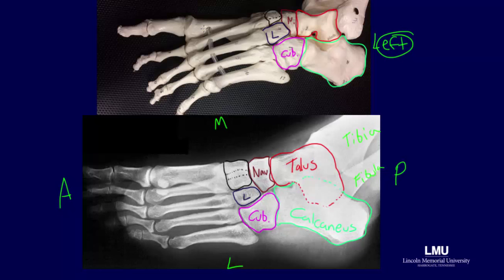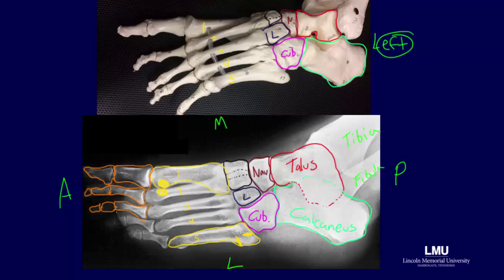After the tarsal bones, we next look to the metatarsals, numbered 1 through 5. The AP oblique view is unique in that it shows the tuberosity of the fifth metatarsal, which can be thoroughly evaluated for any signs of fracture or other injury. A Jones fracture is a type of fracture that can occur at the tuberosity of the fifth metatarsal, but in children it is important not to confuse a Jones fracture — which occurs transverse to the axis of the metatarsal — with an apophysis, which occurs along the longitudinal axis. Evaluation of the AP oblique view is concluded by evaluating the cortices of each of the phalanges. Key highlights of this view include the lateral cuneiform and tuberosity of the fifth metatarsal.